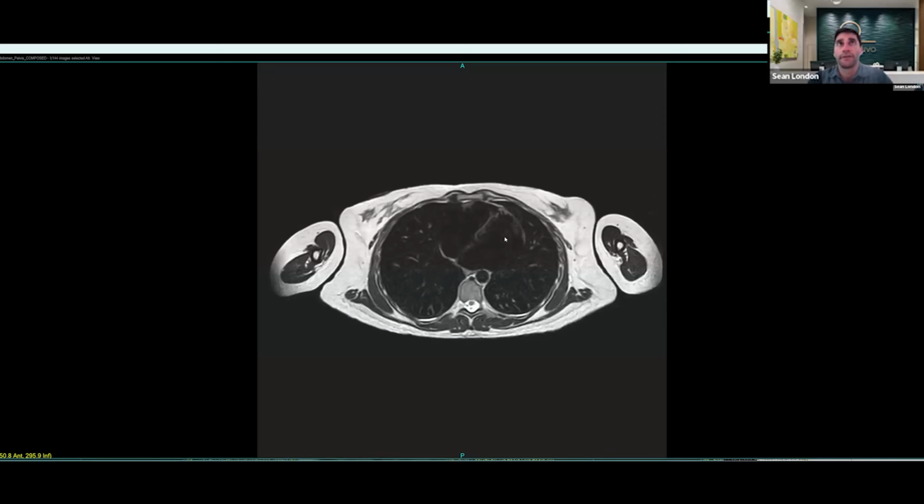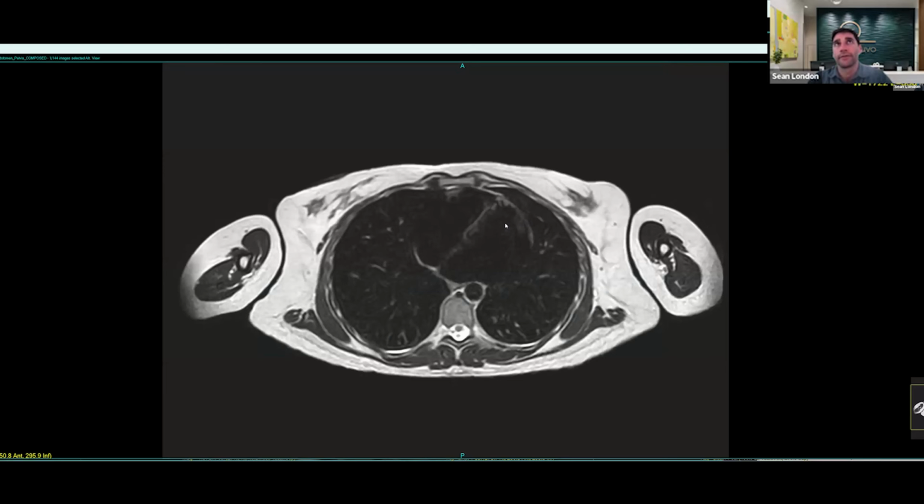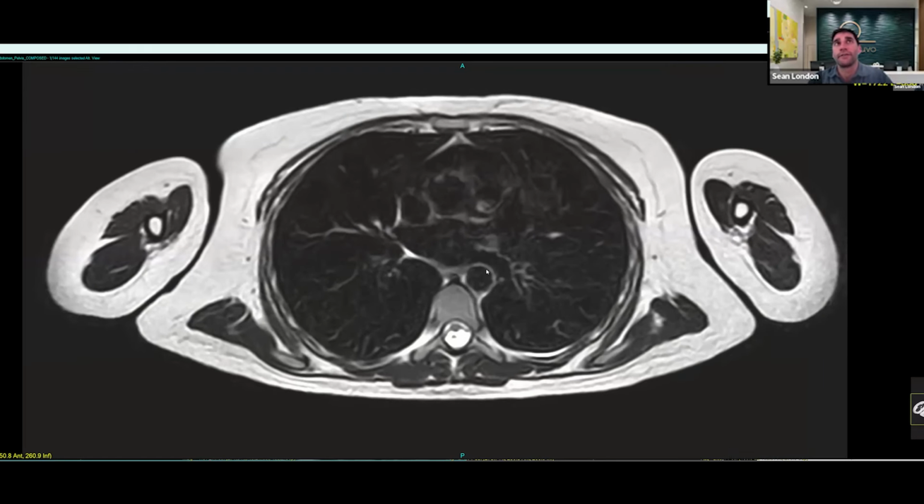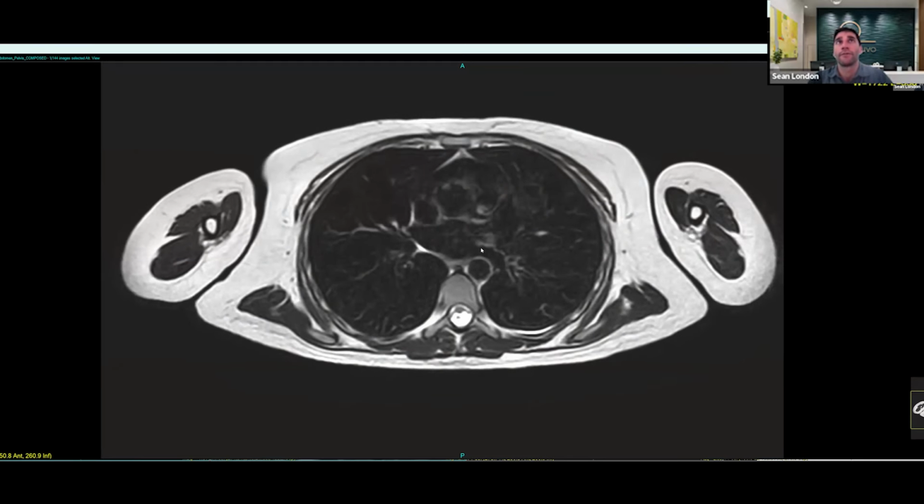In our exam, because this is a screening setting, we cannot see the heart vessels. I will never comment on them on this test. I can't even see them really. The larger arteries, like the aorta and the major branch vessels coming off of it, I can see, and there are secondary signs or clues that there could be blockage within these. What I'm looking for is this black signal within the vessel itself. This is called flow voids, when the blood is moving normally in healthy vessels. There's no signal detected because it's moving so fast, and so it should be black like this.